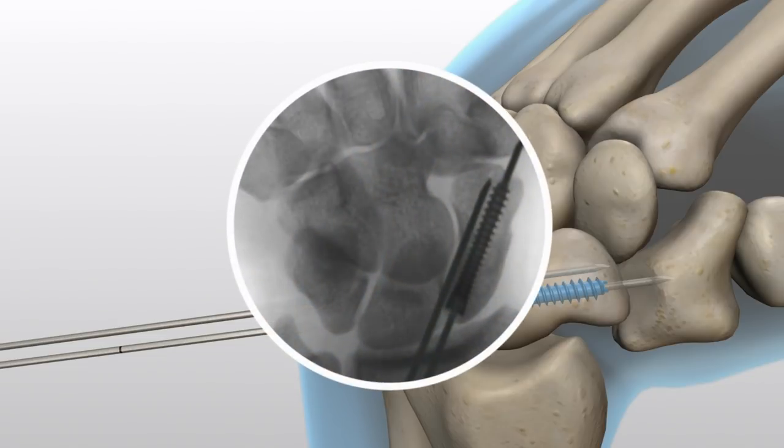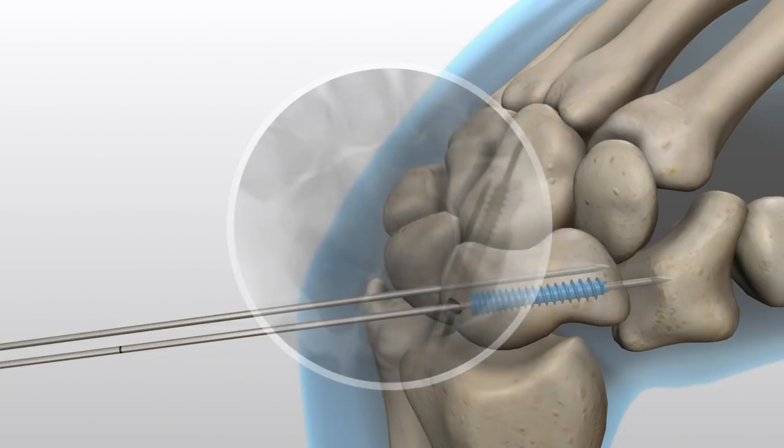Determine correct screw positioning and length under imaging. Remove the guide wires.